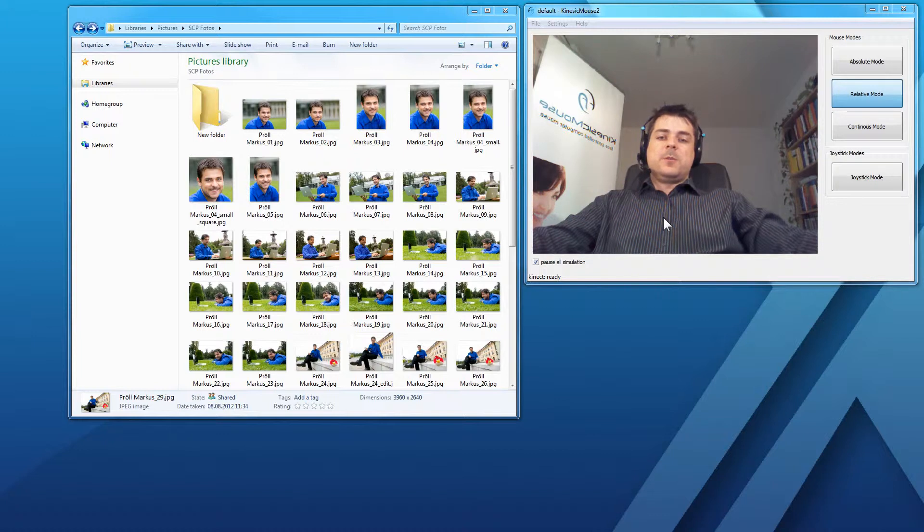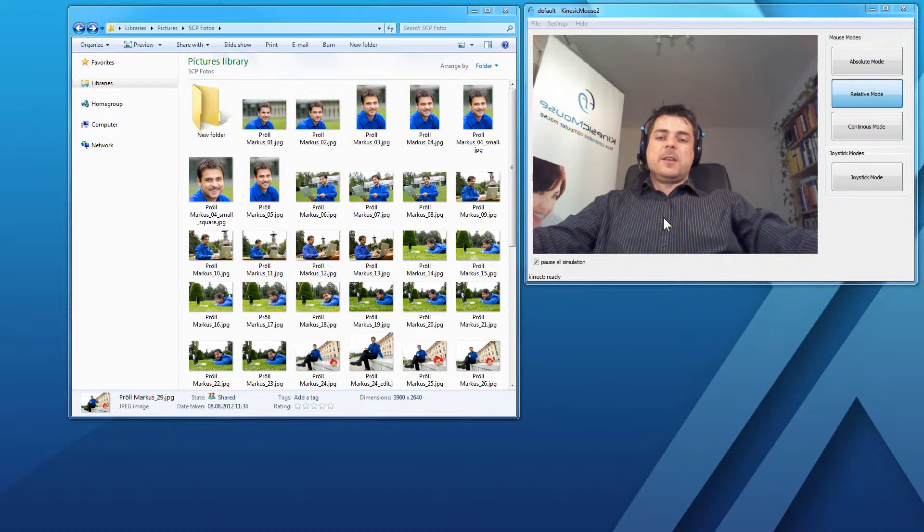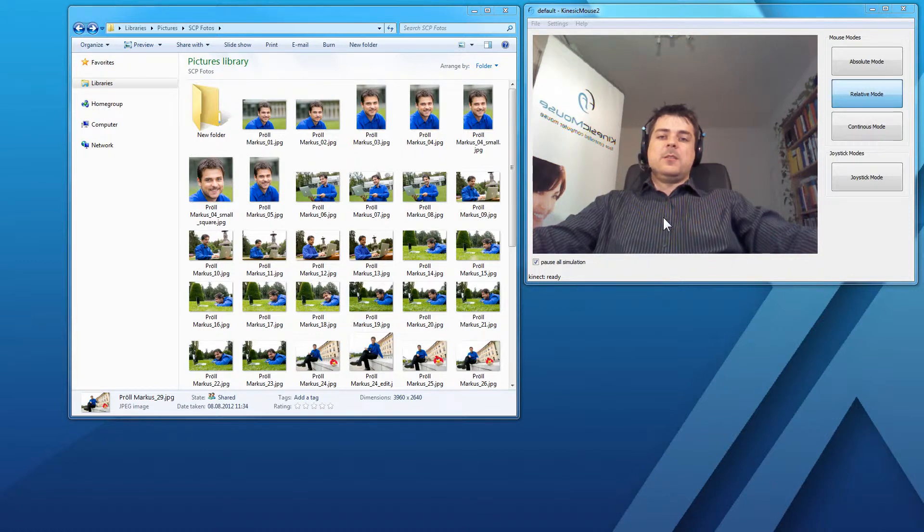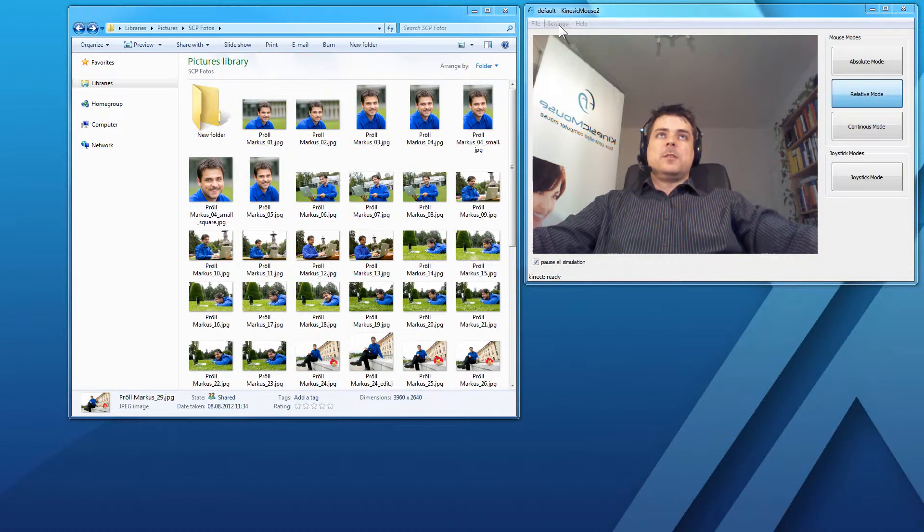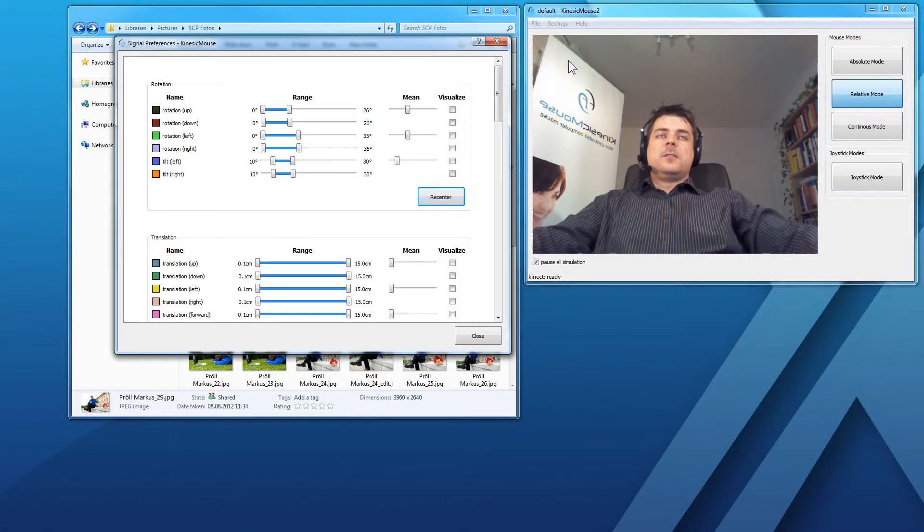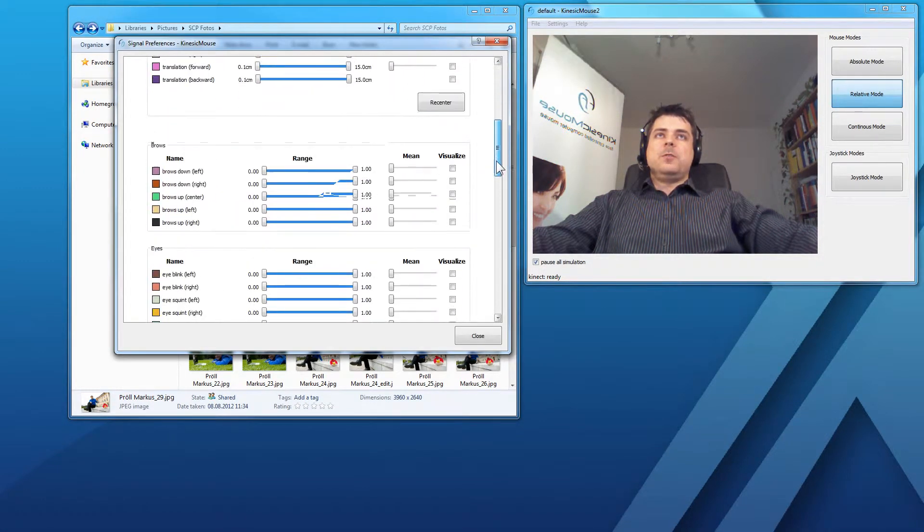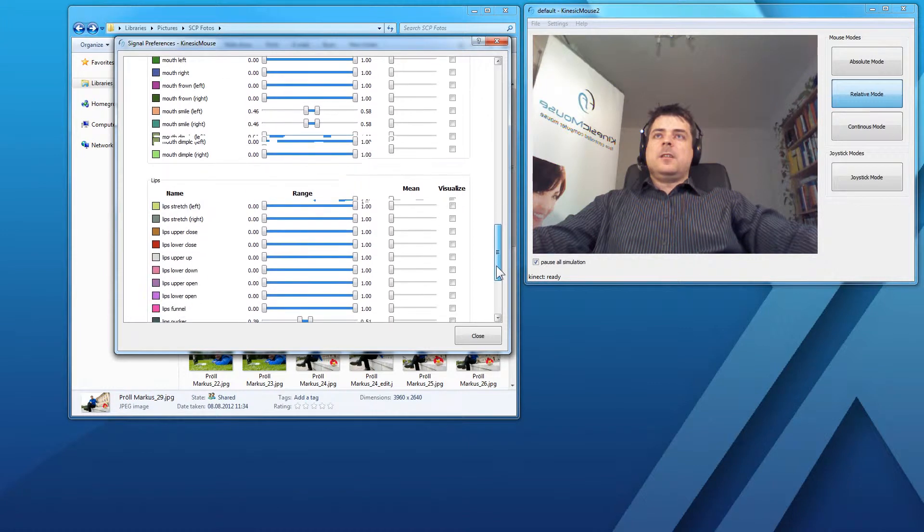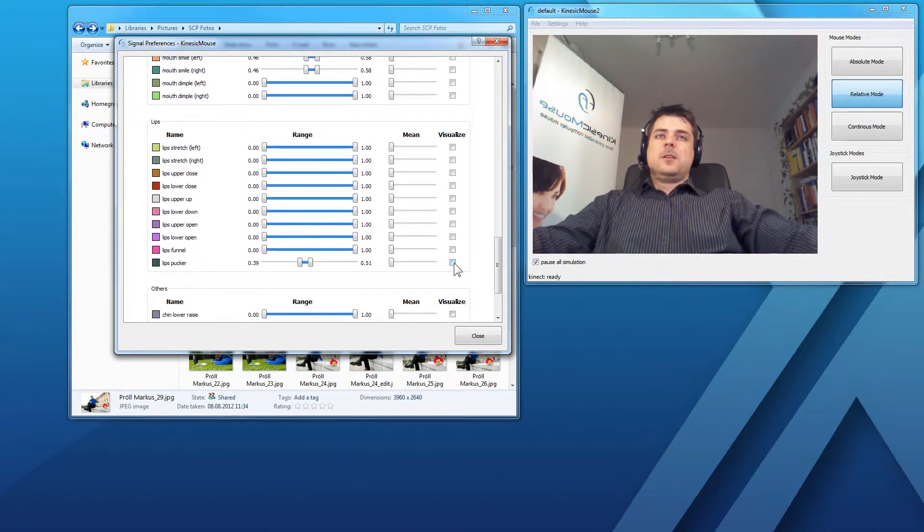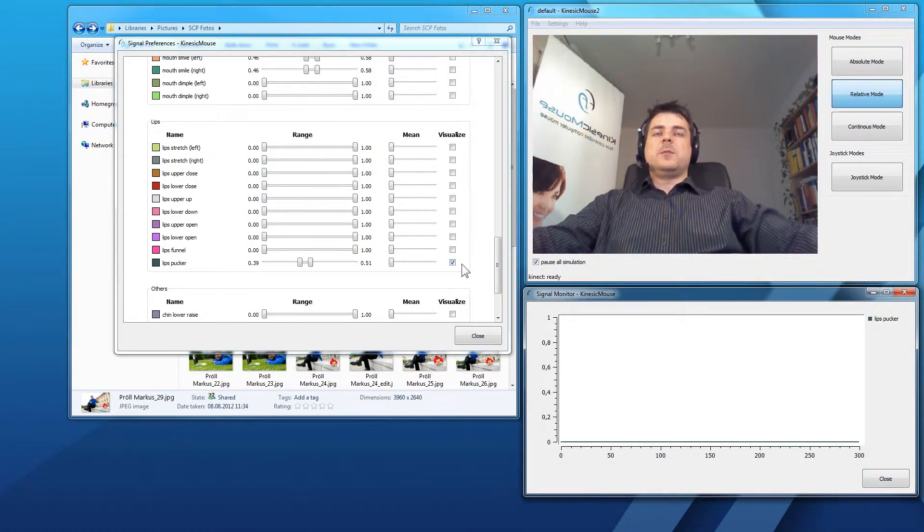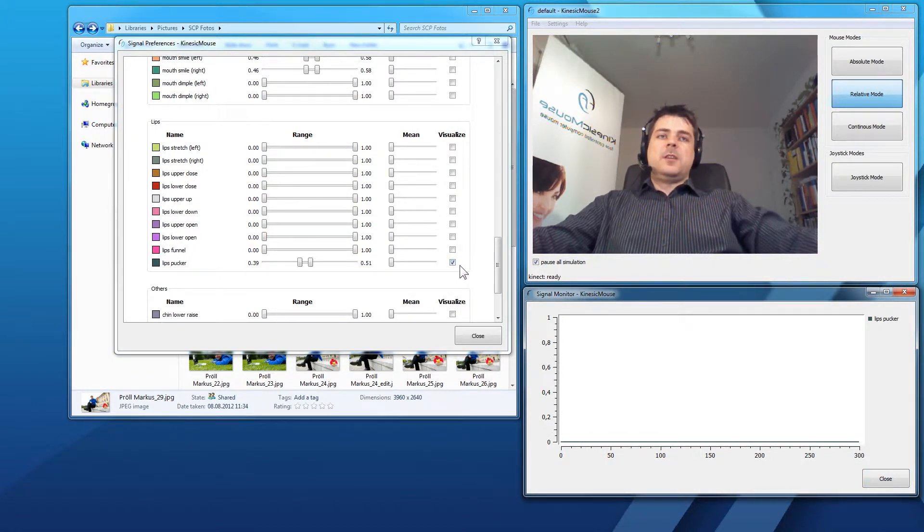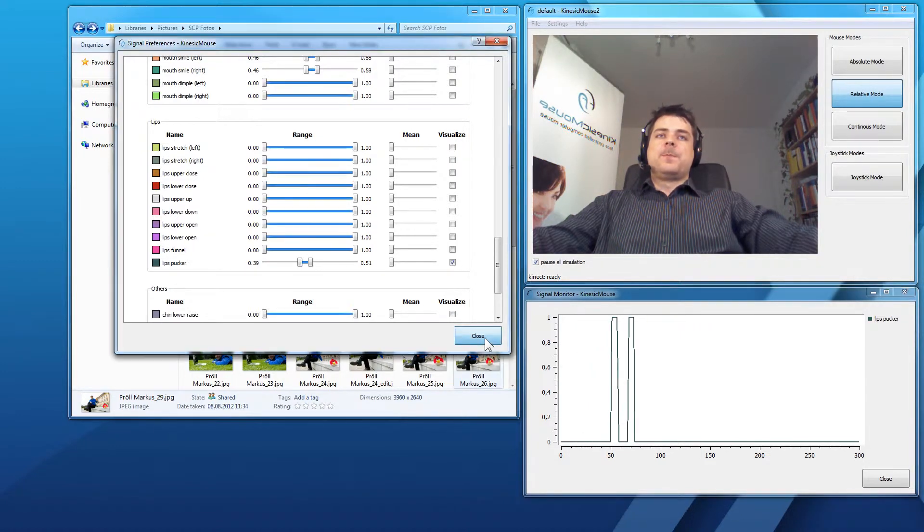First, what I'm going to do is to show you the signal that I'm actually using for this click and drag. In this example, I will take the lips pucker. Let's go to settings, signal preferences, scroll down to the lips and there we have our lips pucker signal. I've already set it up and I will check the visualize mark. When I'm performing this action now, you can see it down here in the signal monitor.